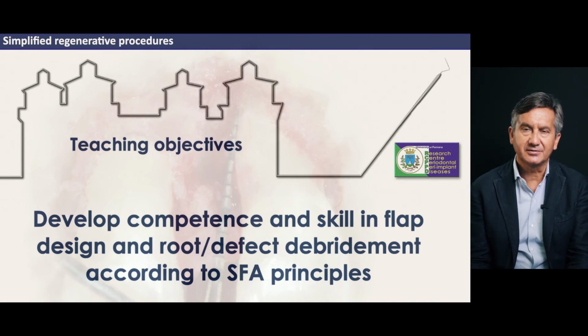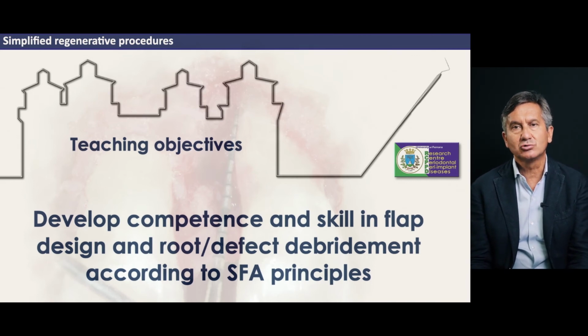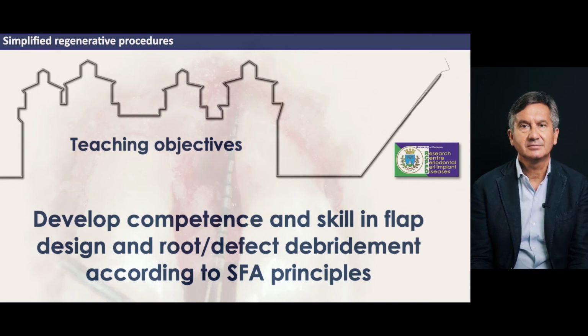The teaching objective of this part is to develop competence and skill in flap design, particularly the flap outline, and the root defect debridement according to the SFA principle.